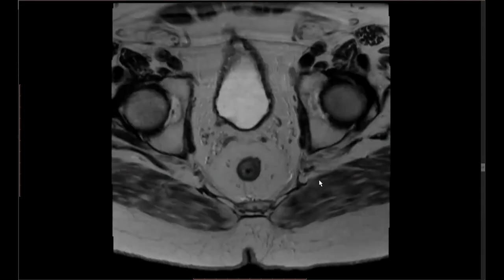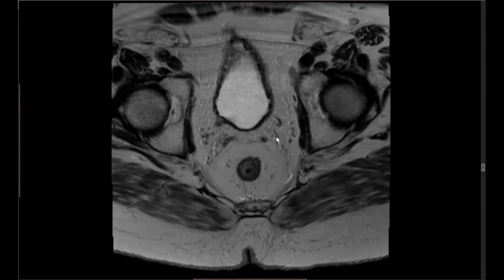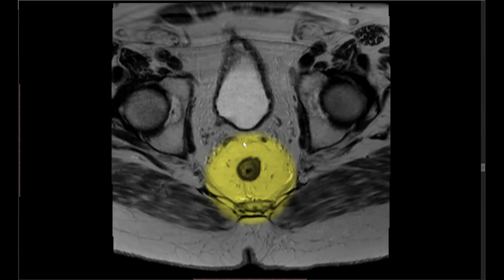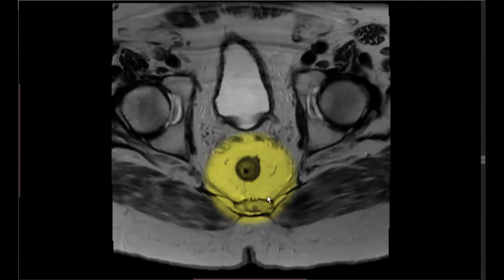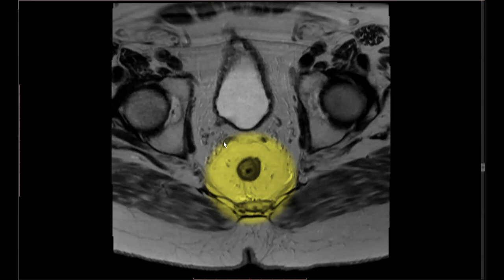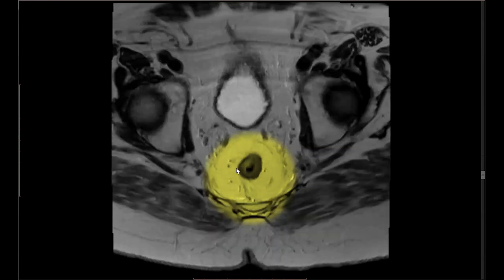The next important structure is the mesorectal fascia. In both male and female pelvis, you have the endopelvic fascia, which supports pelvic organs. The endopelvic fascia has two components: the visceral component, which covers the pelvic organs, and the parietal layer, which covers the muscles and ligaments. In the case of the rectum, the visceral layer is a thin, transparent layer surrounding the rectum referred to as the mesorectal fascia — a dark line nicely seen on MR that surrounds not only the rectum but also the mesorectal fat, vessels, and small lymph nodes.